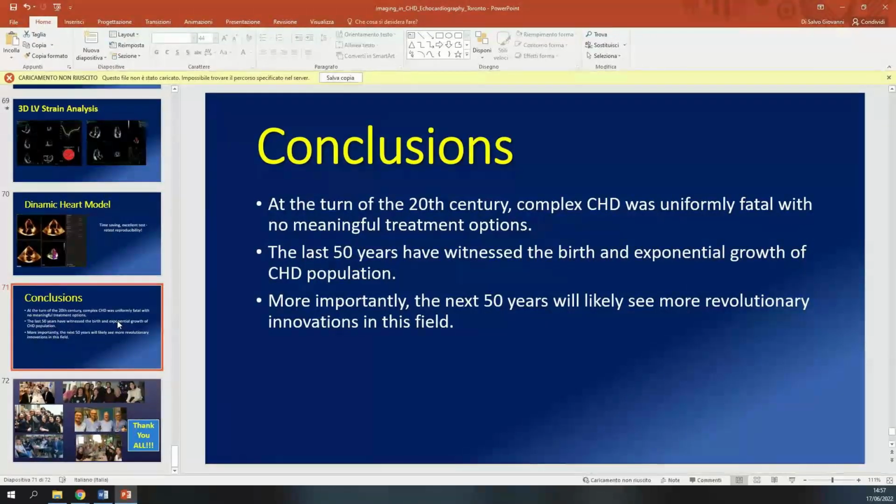So speckle tracking has some limitations in adults with congenital heart disease, and I'm always concerned about the reproducibility of the measurements we obtain. That's the key when we want longitudinal data, and you also mentioned it's very important. We need to rely on the numbers we get. So thank you very much.